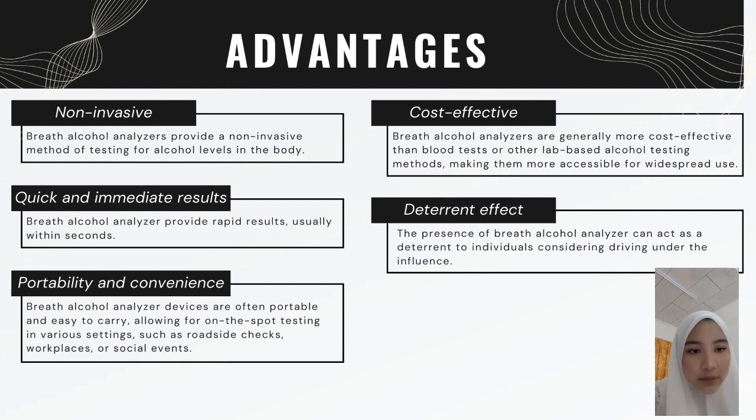The advantages of using breath alcohol analyzer is non-invasive. Breath alcohol analyzers provide a non-invasive method of testing for alcohol levels in the body. They only require a breath sample, eliminating the need for blood tests or other invasive procedures. Next is quick and immediate results. Breath alcohol analyzers provide rapid results, usually within seconds. This allows for immediate assessment of a person's alcohol impairment level.